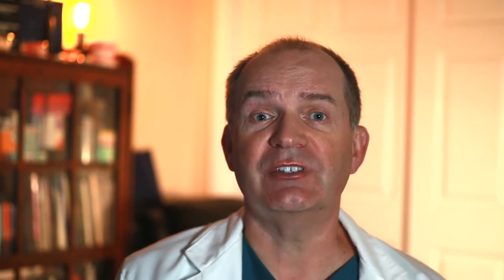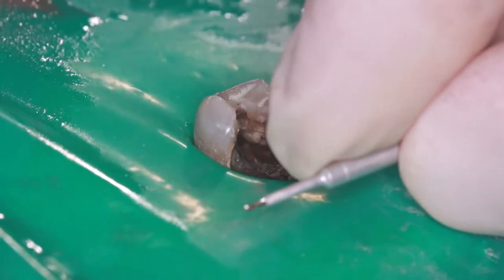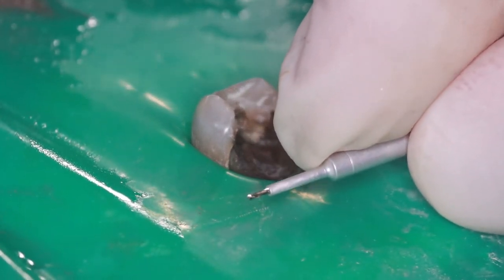Next, I use the correct size drill for the size dental pin I want to place. These are self-threading pins, so the hole needs to be a little smaller than the diameter of the pin. Luckily, the drills are matched with the pins so that the hole will be the right size, and the pin can lock itself into the tooth without needing any cement.